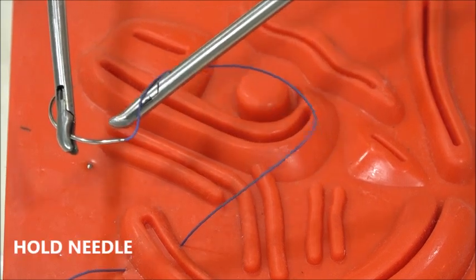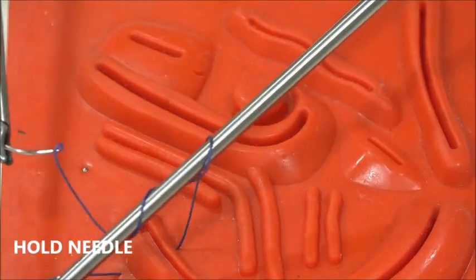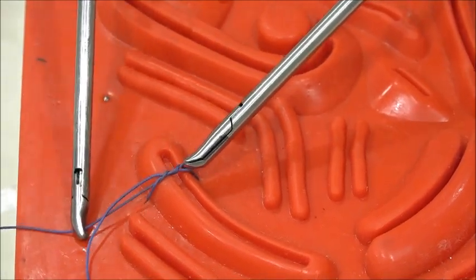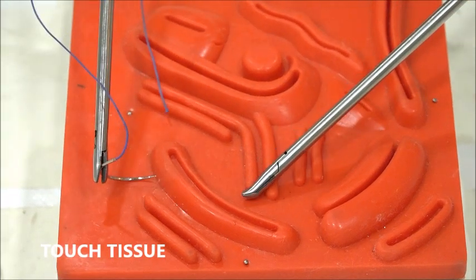Make two wraps of the thread over the left instrument, and the left instrument should catch the tail and should pull in the opposite direction parallel to the tissue. This is touch tissue.